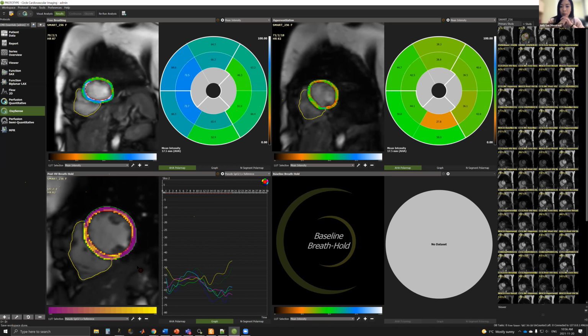Thanks, Matthias. And there's one question from ThinkPad. Sorry to Mitchell, I might have missed the key information, but how does the OxySense module or the TOM module work based on specific dye or other injective drugs? So that's the beauty of this. This is needle-free acquisition. The only stimulus is really the breathing maneuvers. This is why we have the module set up with these different breathing maneuver states that you can look at. But there's absolutely no contrast, no pharmaceutical agents here. It's purely driven by simple breathing.